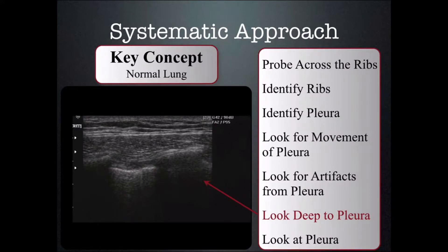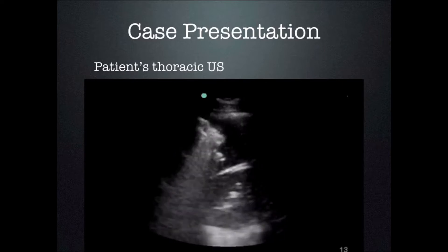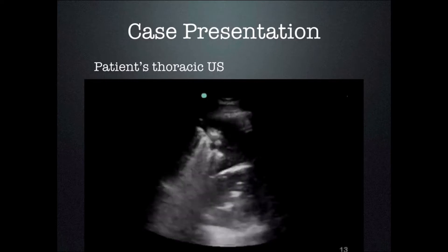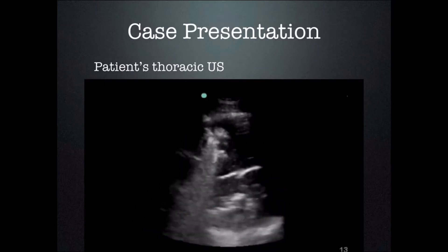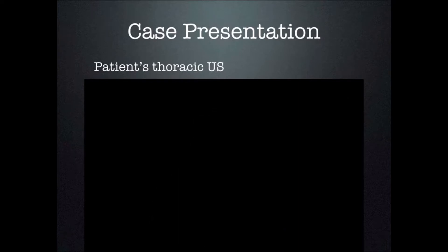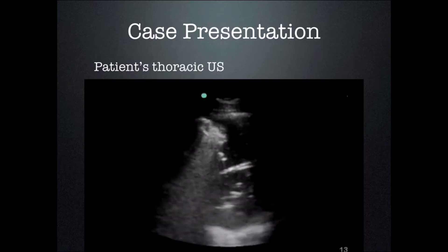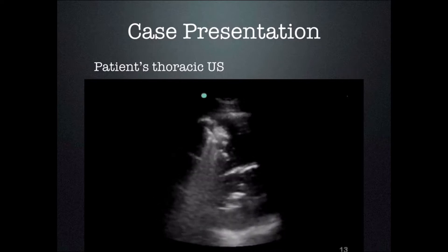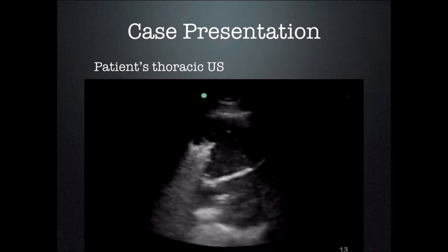We're looking at the patient's ultrasound using a phased array or cardiac probe. Cardiac probes do not image the pleura very well because of the narrow field of view, so we don't see the pleura very well — it's the hyperechoic line at the top of the screen. We see something that looks like a lung rocket, but remember lung rockets must arise from the pleural line, and in this case they do not arise from the pleural line — they are deep to the pleural line.